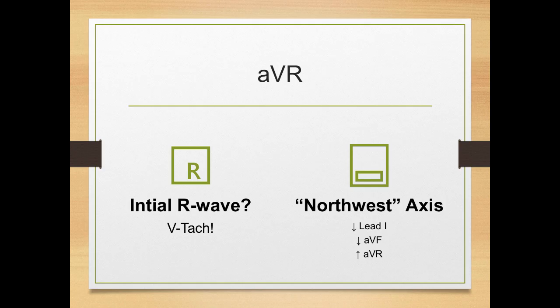Last of all these criteria I want to talk about is this aVR criterion. And I think it's my first stop always, because I think it's the simplest, and it has really high sensitivity and specificity. So we look at aVR. So now we're paying attention to aVR. It's been like an entire semester. We're finally paying attention to aVR.